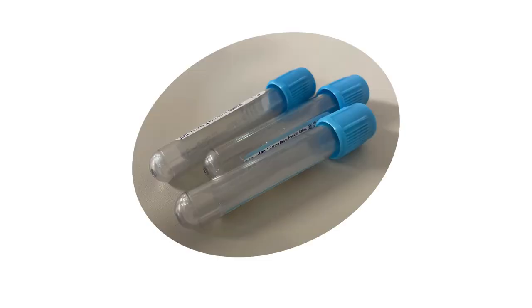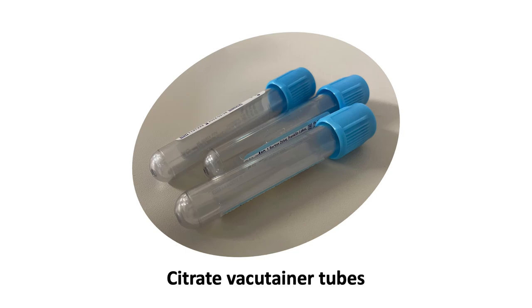Finally, we'll address steps to optimize sample collection. Blood for coagulation testing is collected into citrate tubes. Citrate tubes contain trisodium citrate, which chelates calcium and inhibits coagulation.